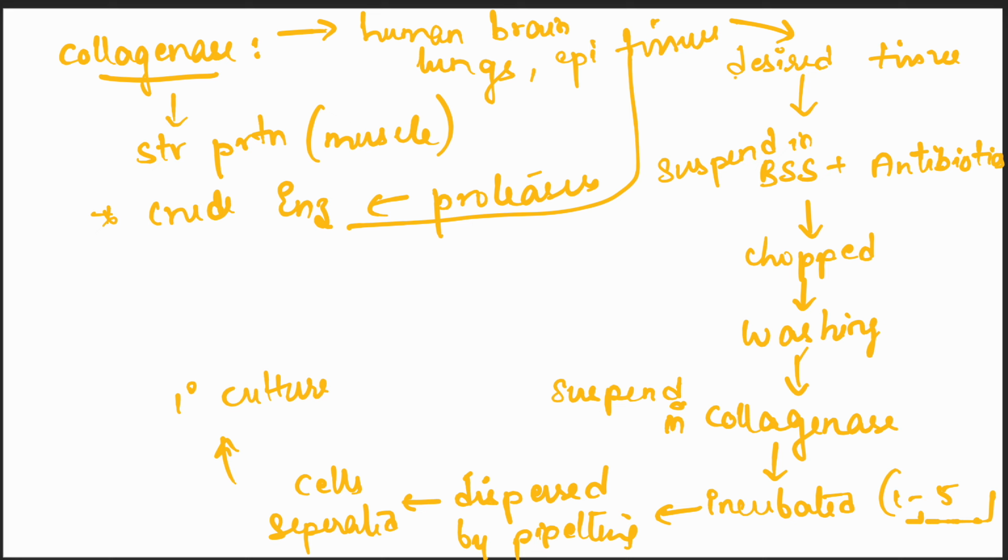Sometimes the enzyme hyaluronidase is used, which helps the collagenase and makes it more effective. The enzyme hyaluronidase.